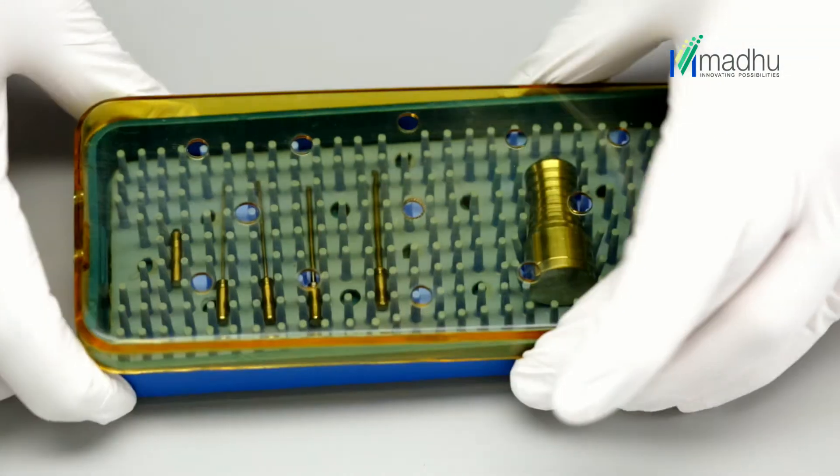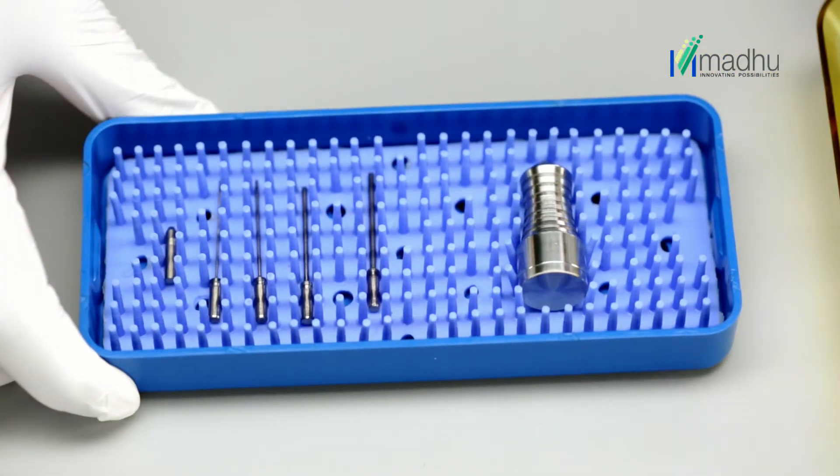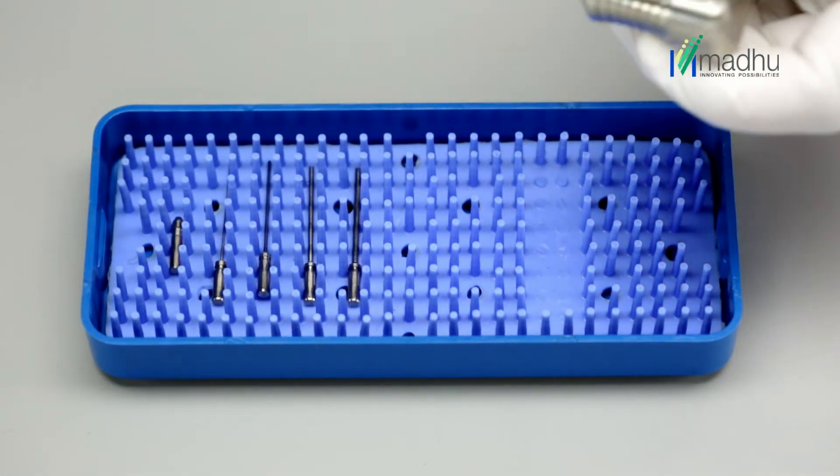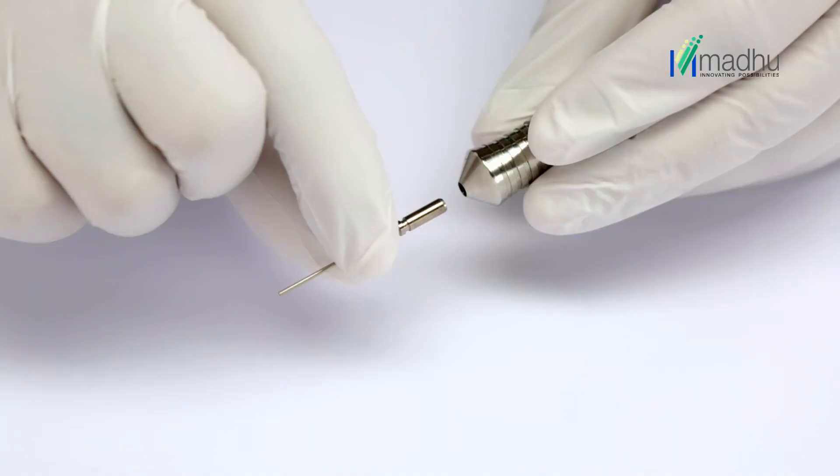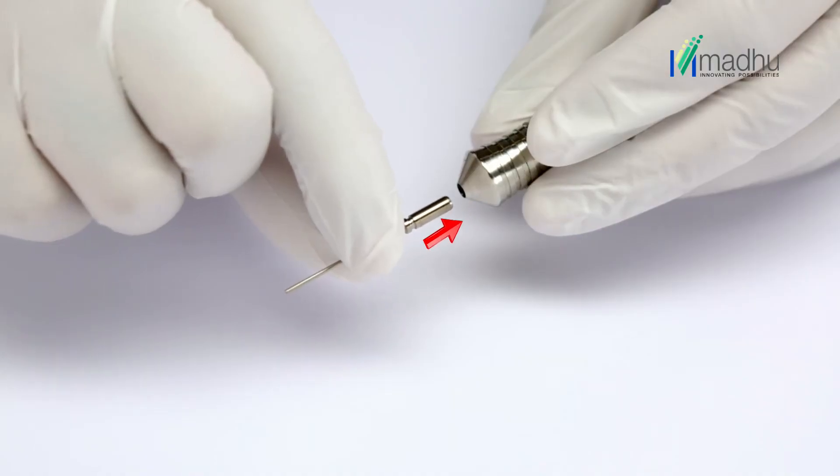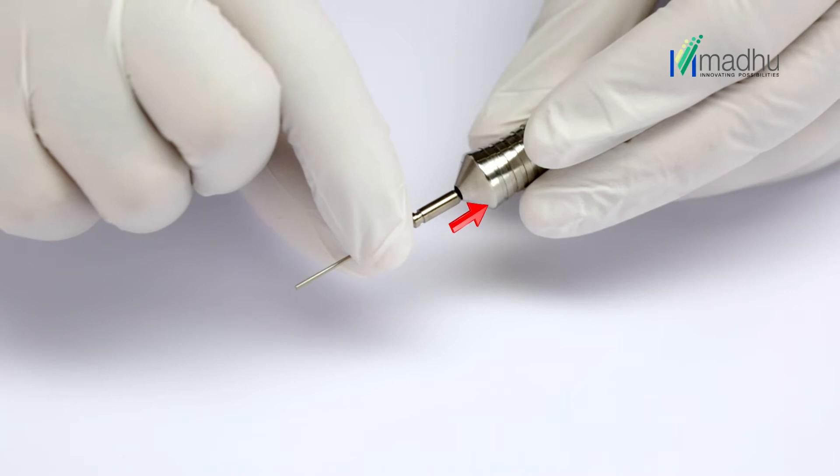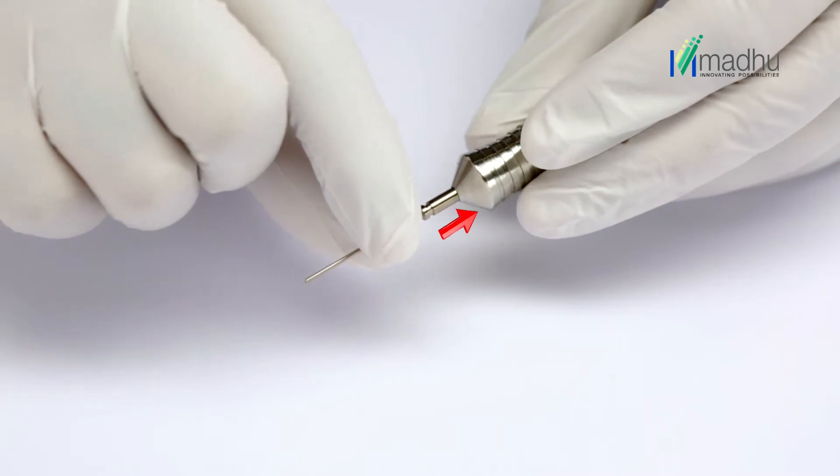Open the sterilization tray and take out the intraocular magnet handle along with the desired gauge of magnet tip. Carefully hold the tip base and position it in front of the handle cavity.